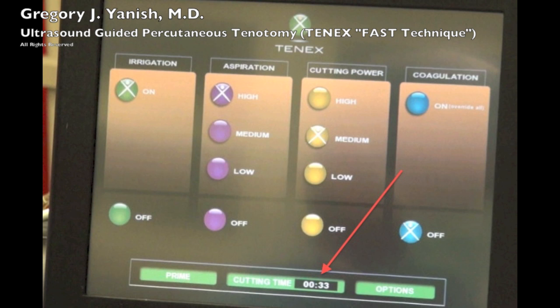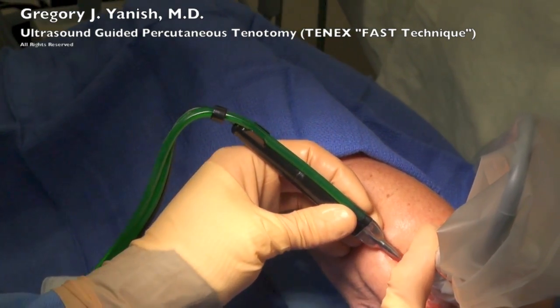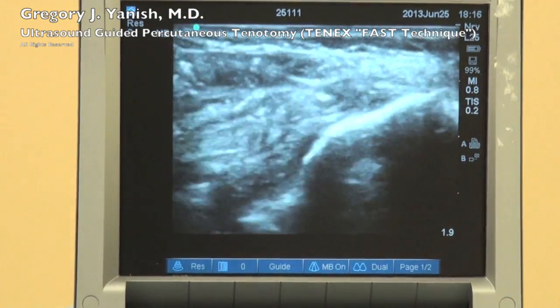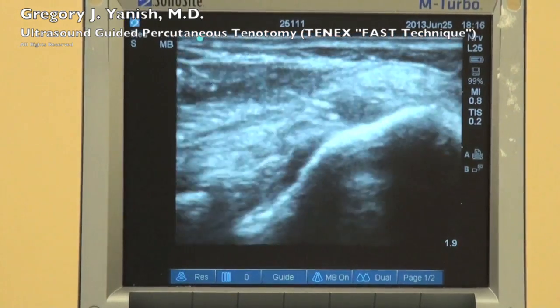Here's the cutting time — this is the actual time that I've been stepping on the pedal. So far we're up to 33 seconds. Typically, we end up using about a minute's worth of cutting time energy. I'm still working away and removing all of that black area, at least as much as possible, that we originally visualized.